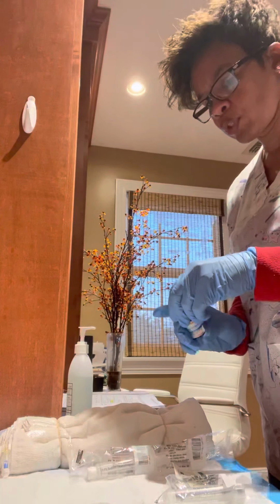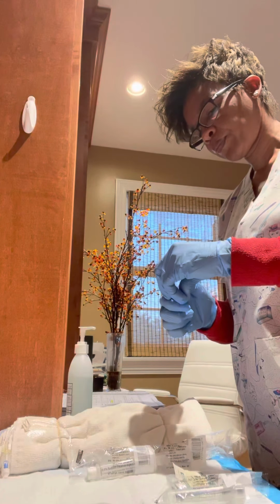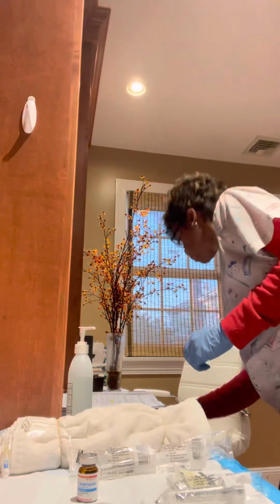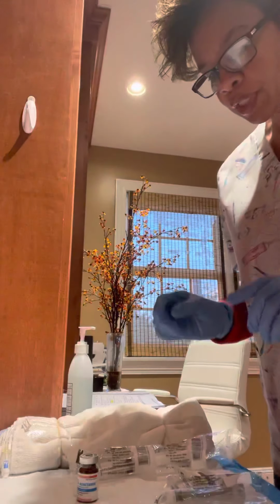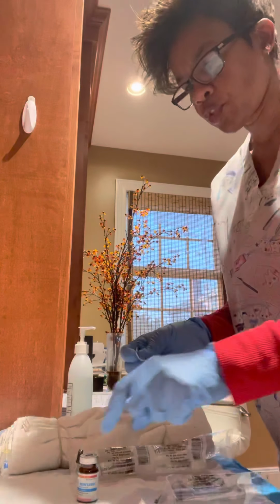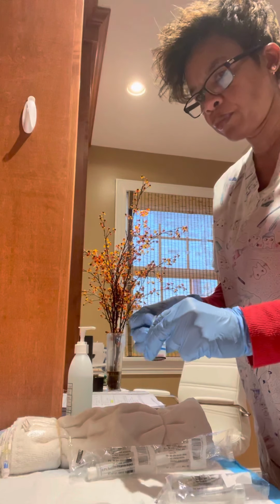So I'm just going to remove the cap. Okay. And then I would get alcohol, and I'm just going to clean the top real good.